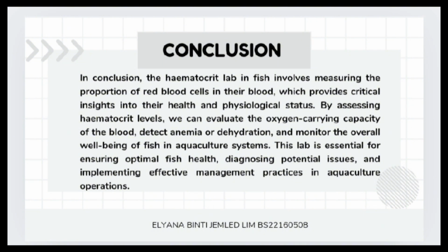In our conclusions, the hematocrit lab in fish involved measuring the proportions of red blood cells in their blood, which provides critical insight into their health and physiological status. By assessing hematocrit level, we can evaluate the oxygen-carrying capacity of the blood, detect anemia or dehydration, and monitor the overall well-being of fish in aquaculture systems.